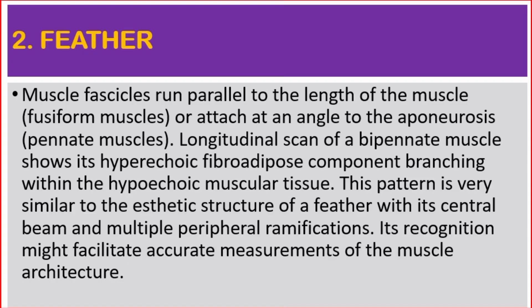Number two: feather. Muscle fascicles run parallel to the long axis of the muscle in fusiform muscles, or attach at an angle to the aponeurosis. Longitudinal scan of a bipennate muscle shows its hyperechoic fibroadipose component branching within the hypoechoic muscular tissue. This pattern is very similar to the aesthetic structure of a feather with its central beam and the multiple peripheral ramifications.